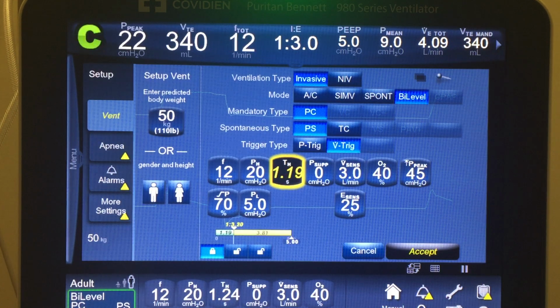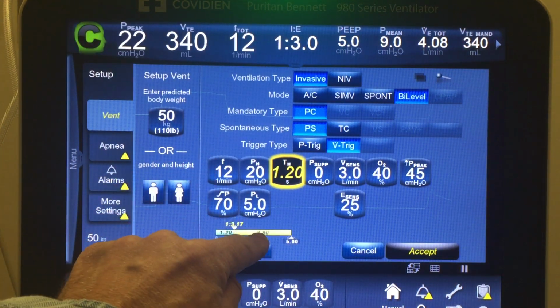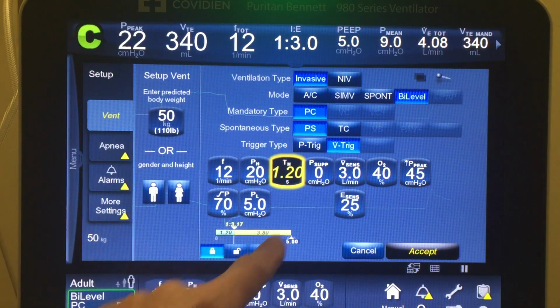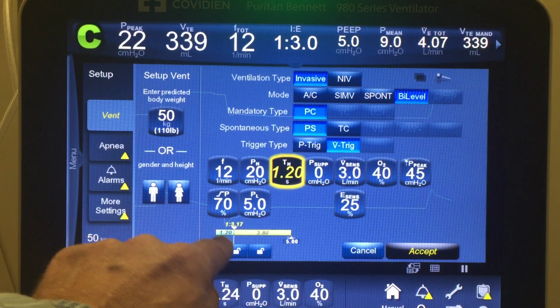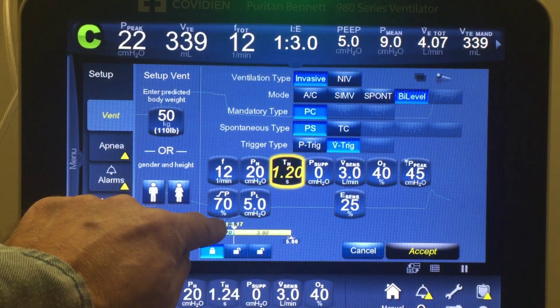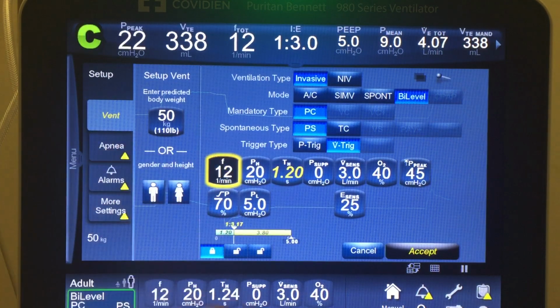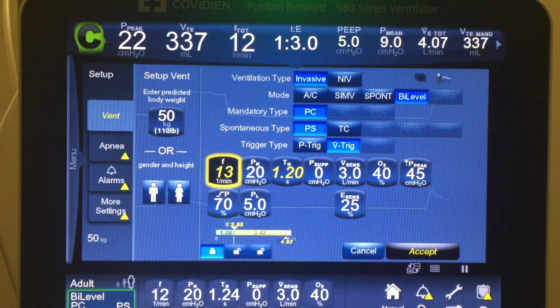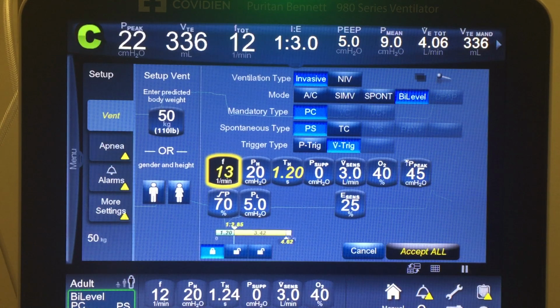Okay, so I'm controlling time high, and I set it at 1.2, which leaves 3.8 seconds. Cycle time is 5, right? 3.8 plus 1.2 gives you a cycle time of 5, and it gives you the IE ratio here as well. So I'm controlling the 1.2 time high, and if I change the frequency, if I roll that up, time high stays the same. Time low changes, okay?